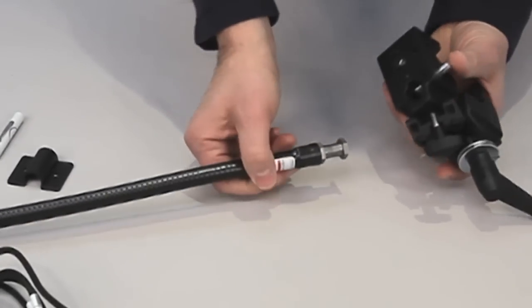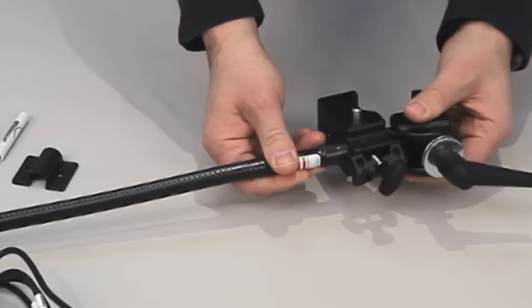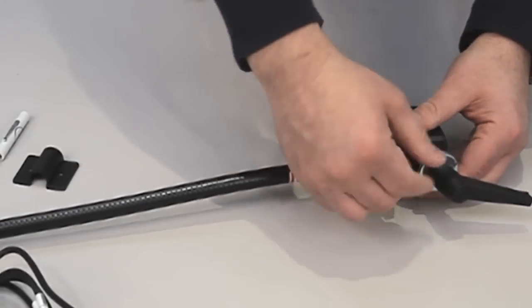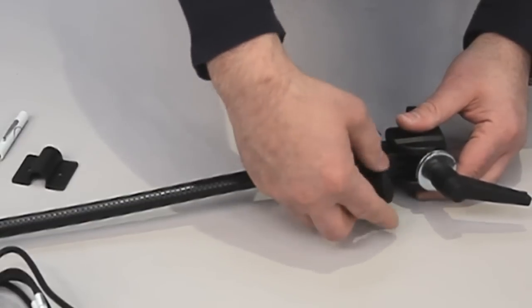And then depress this spring release, and it will lock the clamp in place. Now it's not going to move, but if you want to make it extra secure, you can just tighten this up.